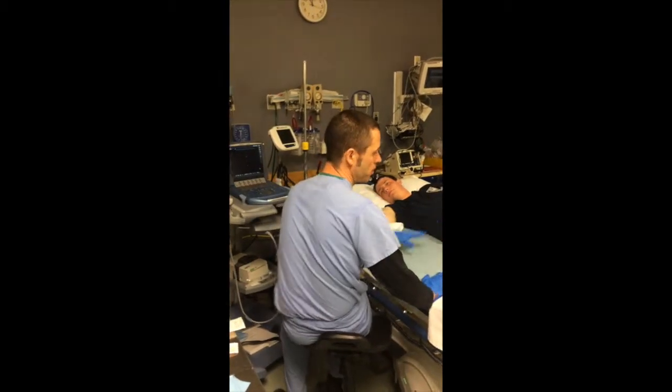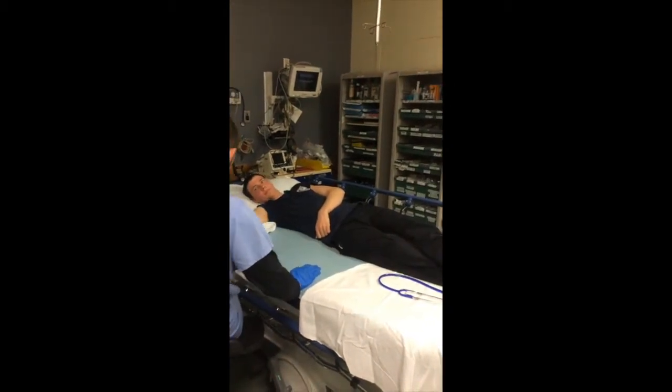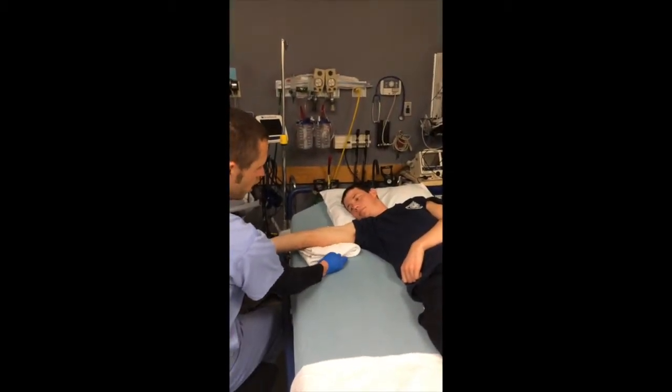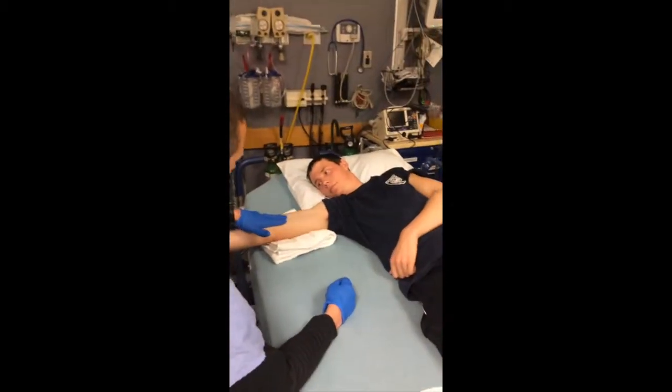The first thing you want to do is have proper patient positioning as best you can. If you can get them supine, you want to extend this arm out 90 degrees and rotate it. I usually put a washcloth or a little towel here just to get a nice flat surface exposing the upper arm.